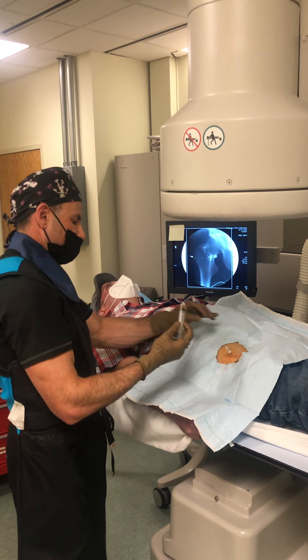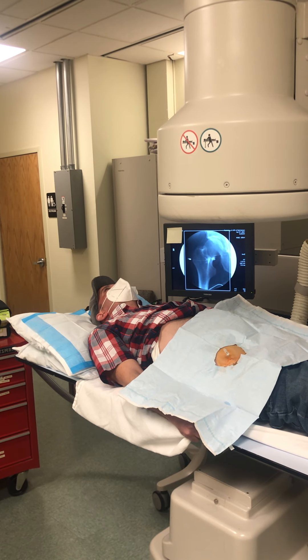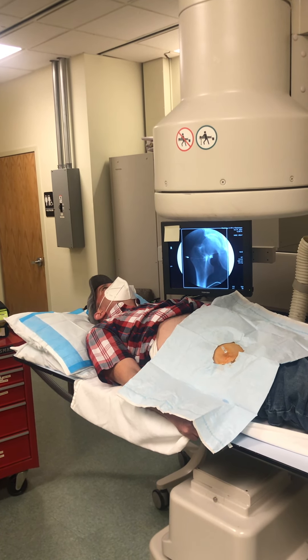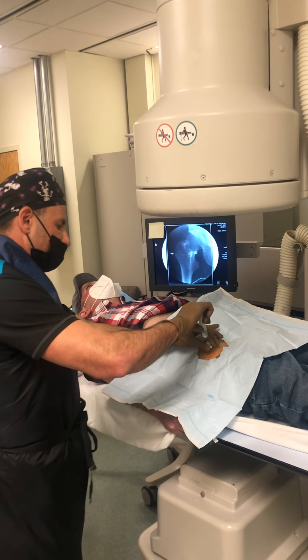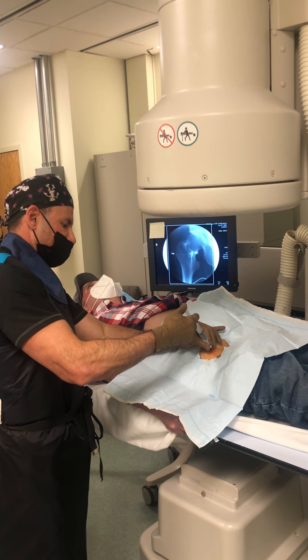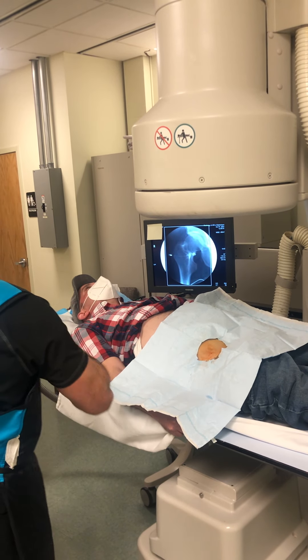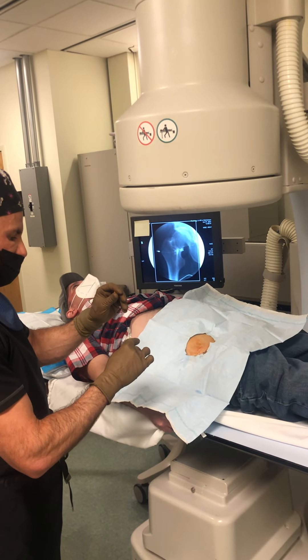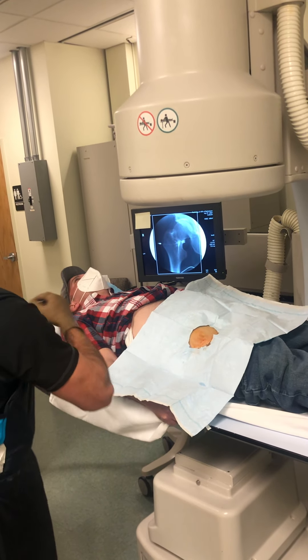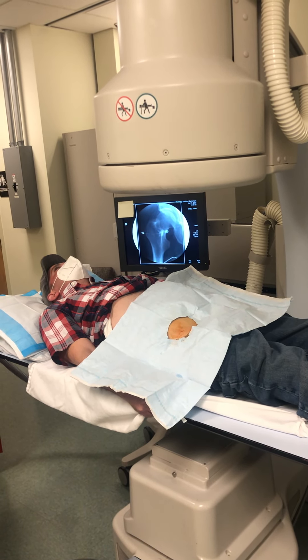Building more pressure. And we're going to push it out with some lidocaine as I take this needle out. Now we're going to go to the inner portion of the hip and go to the actual space and place the needle right in there.